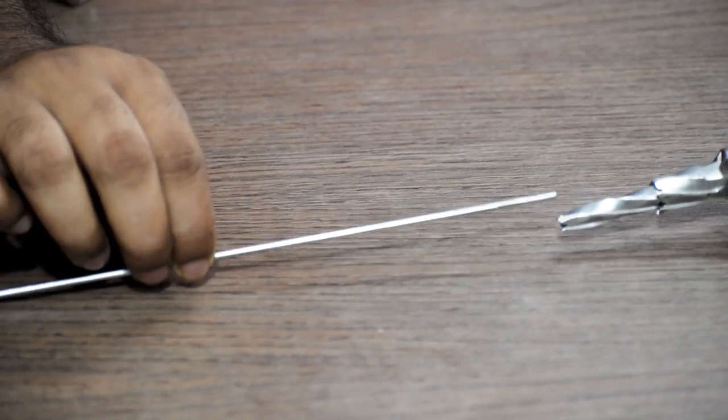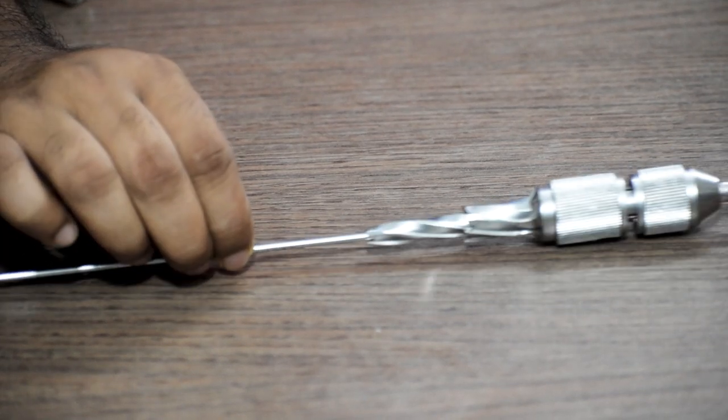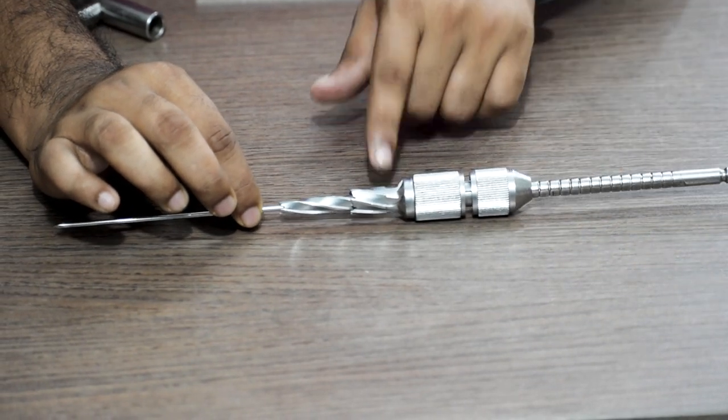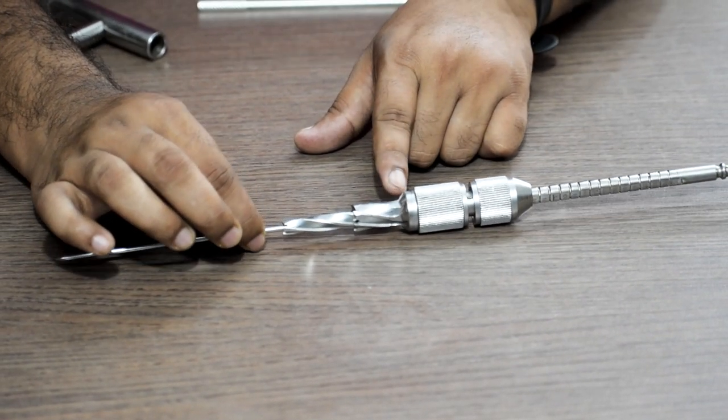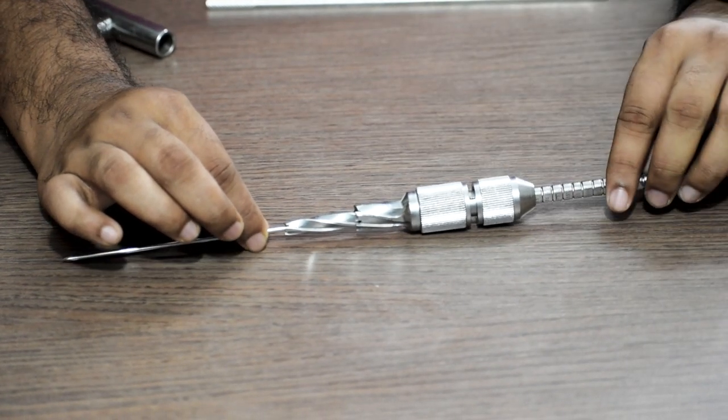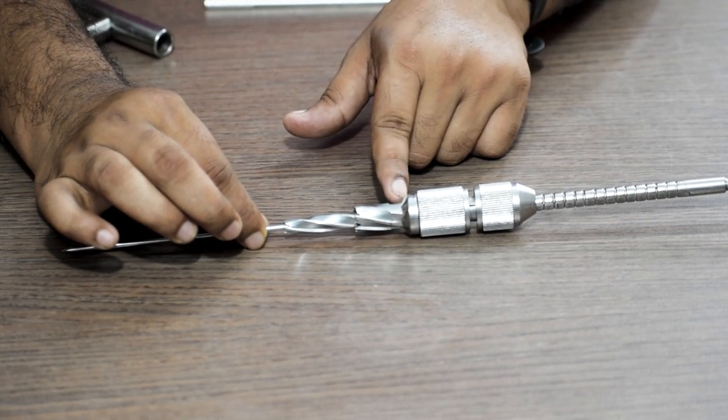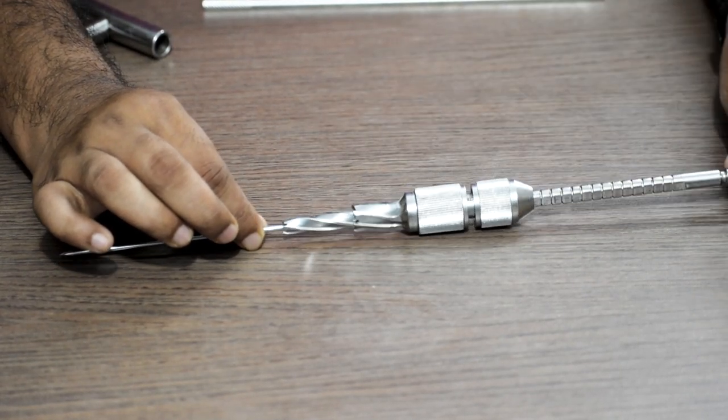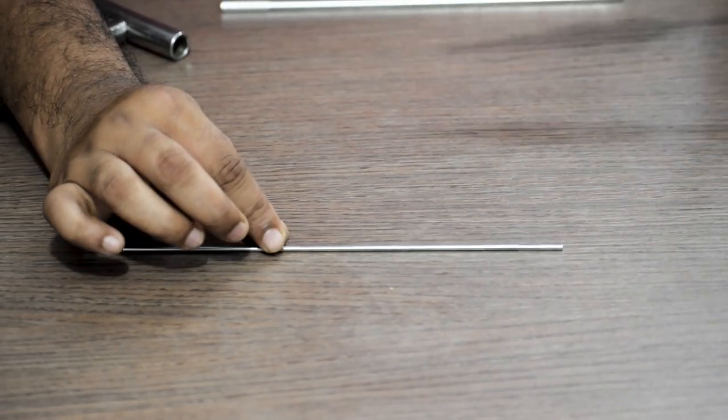Once done, then we lock it and use it to ream through. This part will touch the cortex of the bone. We will ream till this part touches the outer cortex of the bone, and then we take the reamer out.